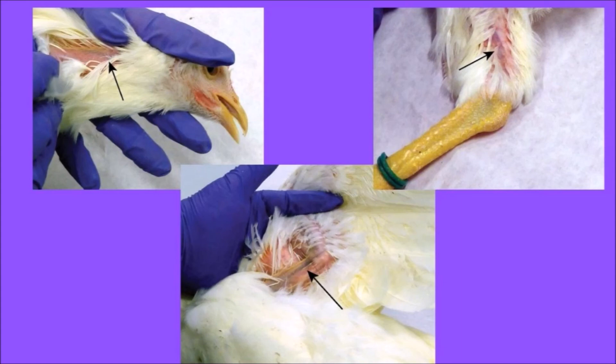In raptors, the brachial vein is often used to take blood samples or insert temporary catheters for repeated intravenous treatments. The medial metatarsal vein is located on the ventral medial side of the leg, extending from the metatarsal dorsally over the heel joint. Blood samples are sometimes taken from this site in raptors, but it is more commonly used for waterfowl species.